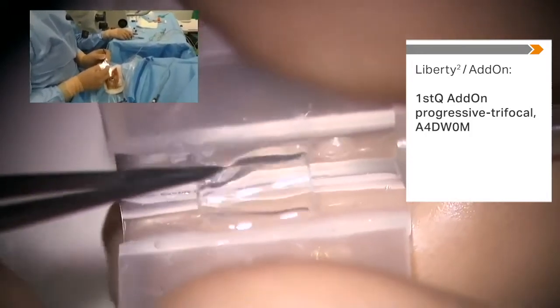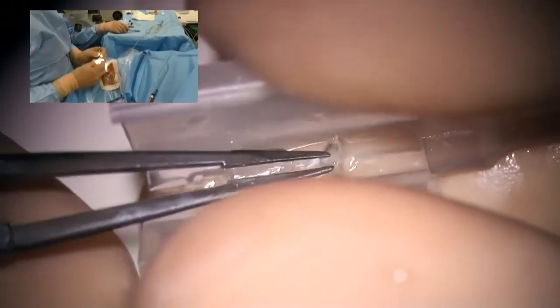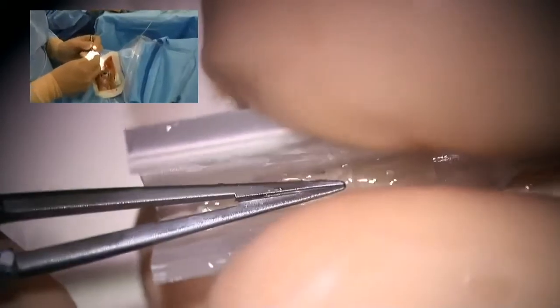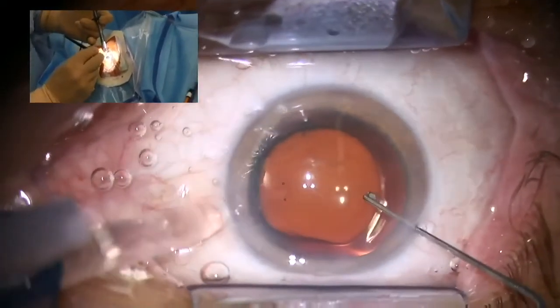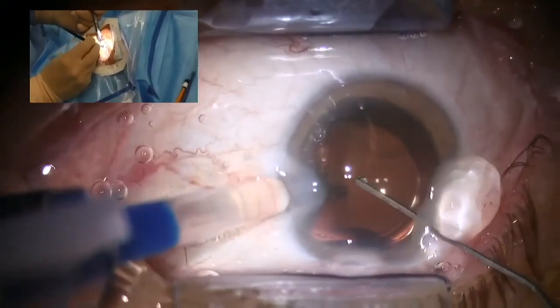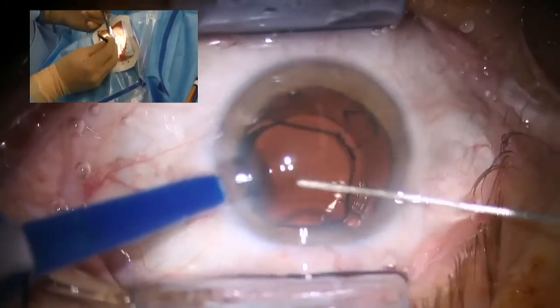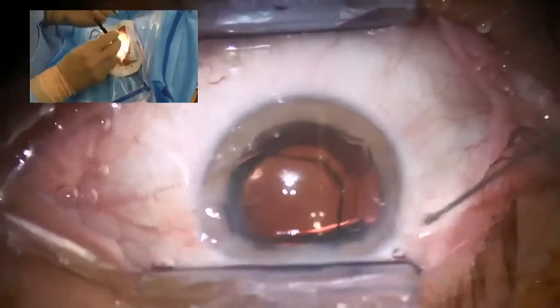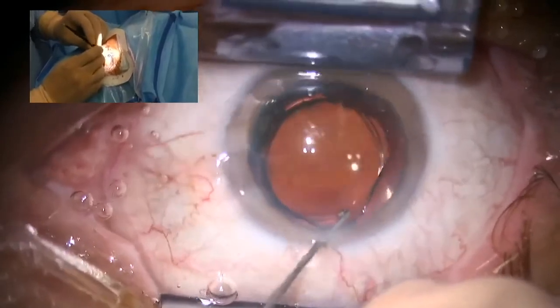If you have an upside down implantation, you have to remove the lens. So again, inverse U shape. Press the optic downwards. Check for incarceration. So again, you see my cartridge is inside the 2mm incision, not inside the eye, but inside the clear corneal incision. I use the second instrument as a leading instrument to help the add-on lens unfold properly, and then again the positioning underneath.